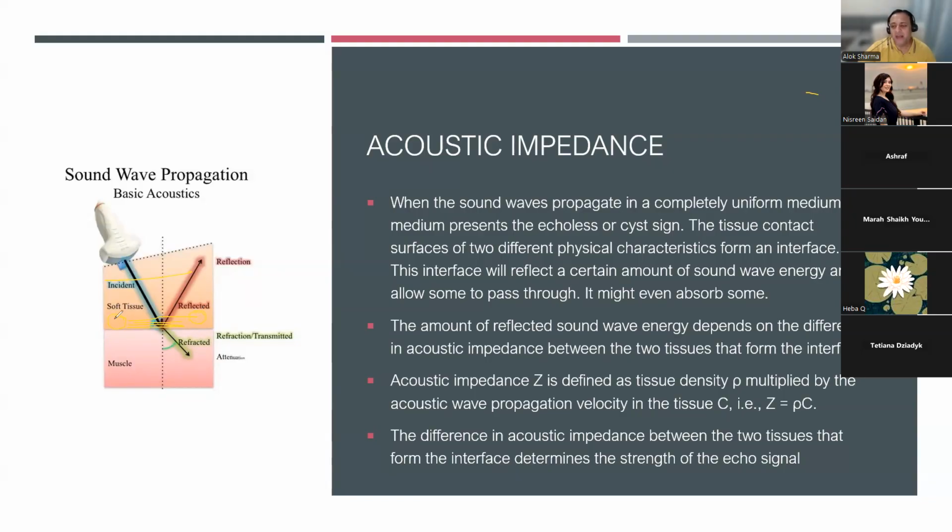So the difference in the acoustic impedance when you go from a high density to the pleura, which is medium density, as opposed to air, which is low density, means that there will be high reflection back from the bone. And because of this, sound waves will not be able to enter. For that reason, you get dropout behind the ribs.